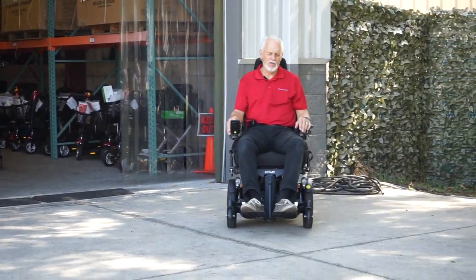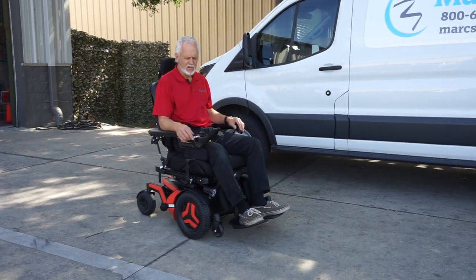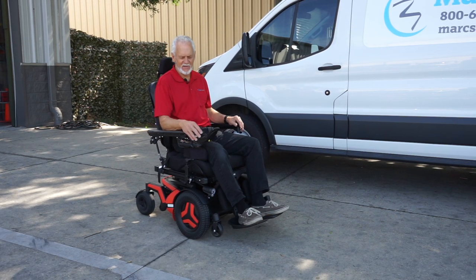Top speed is 7.2 to 7.3 miles per hour on this power chair — the Permobil F5 VS vertical standing. A really nice power chair.